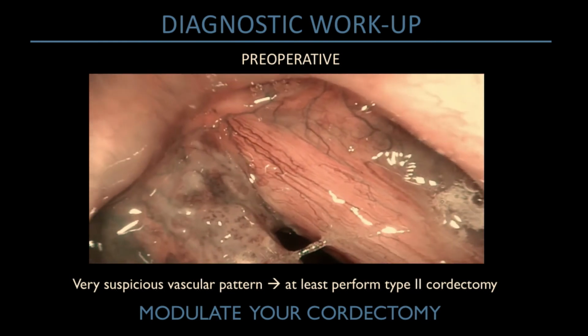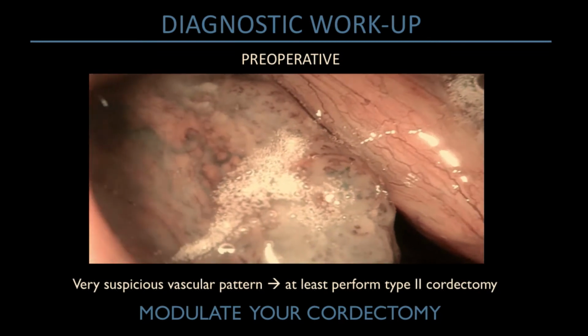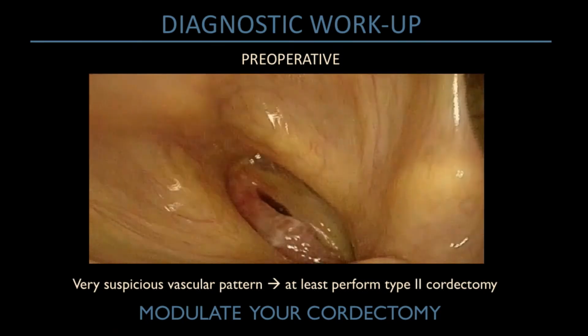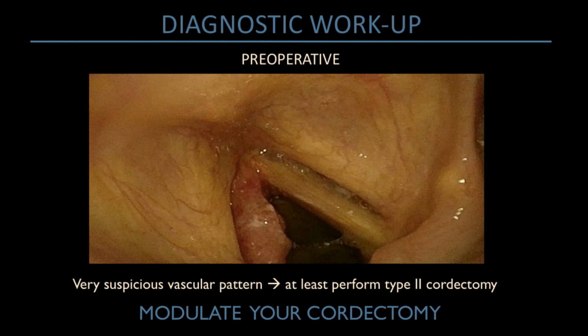And of course, in the healthy vocal cord you can see the longitudinal, physiological direction of the vessels, while here the direction is completely abnormal. Of course, you can combine this information in the office with video stroboscopy. The new tower gives you the possibility to have stroboscopy information also.